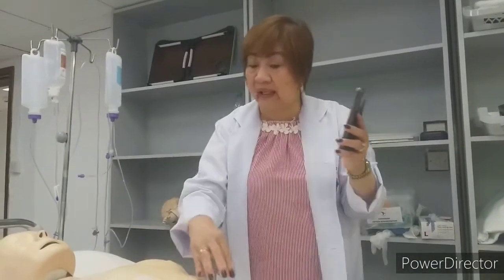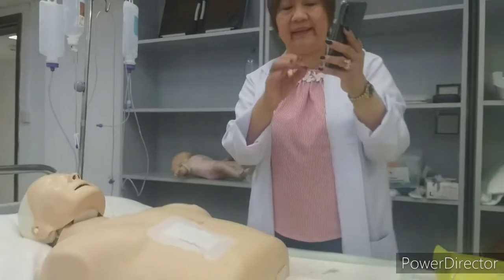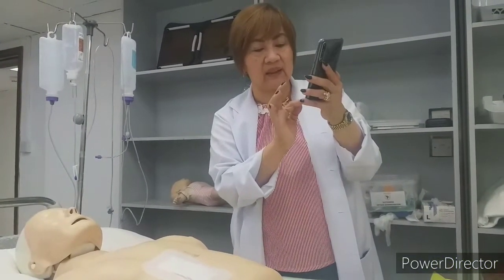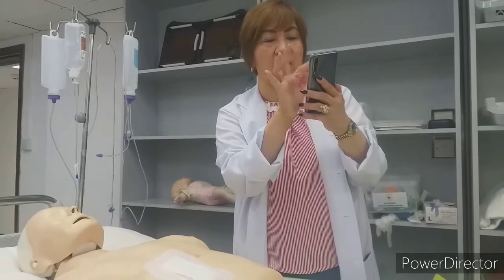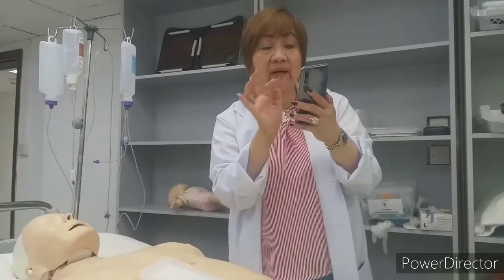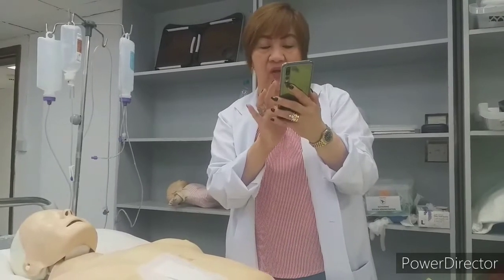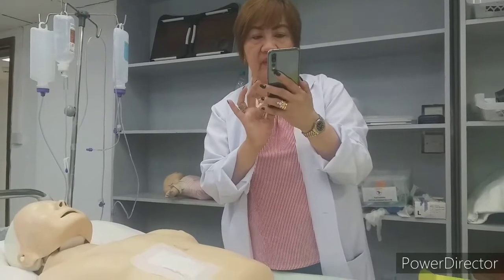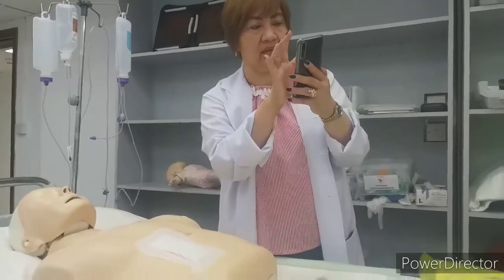Clean, or put your gauze here, throw that one, and come back to clean. The disposable colostomy bag is better. There are also different colors of colostomy bags.